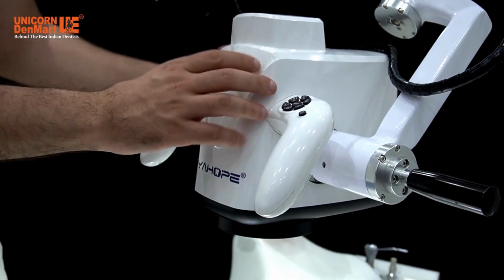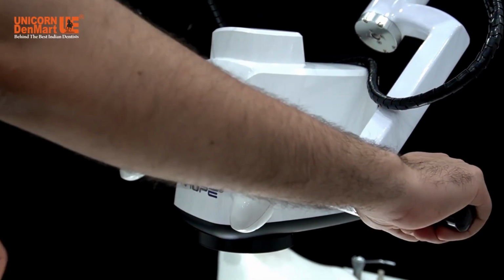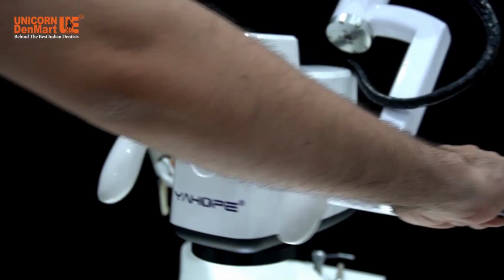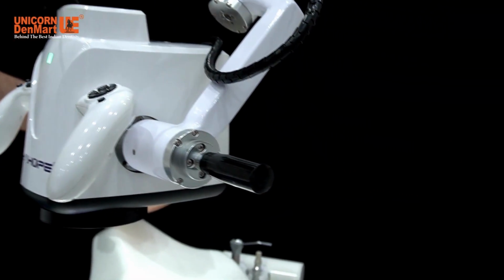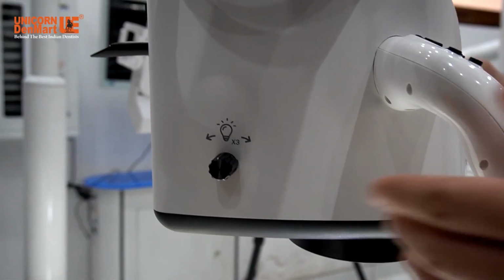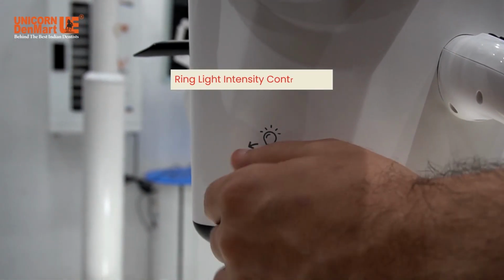The overall design of the machine is quite compact. You get this bar with which you can move your entire microscope, right? Then you get two knobs here which are for adjusting your ring light and brightness. For example, if you look at this knob, this will be the ring light knob. You can increase or decrease it as well.